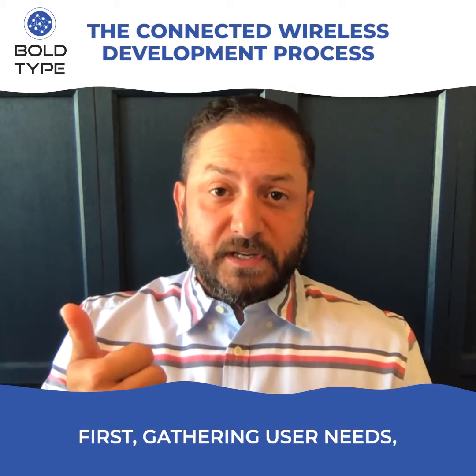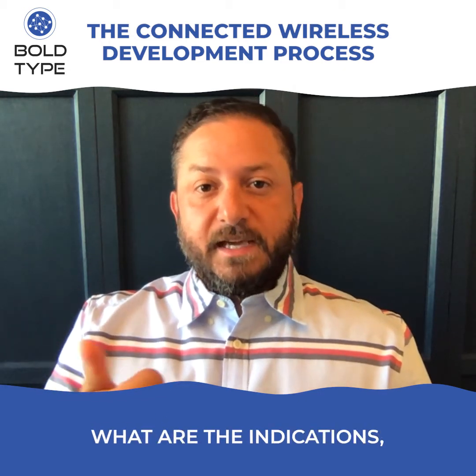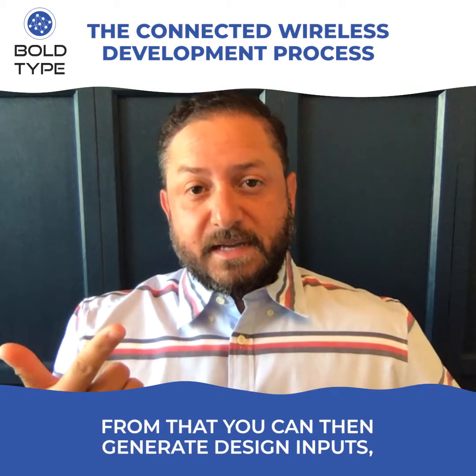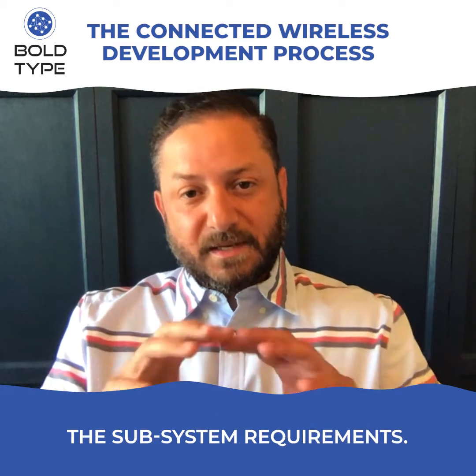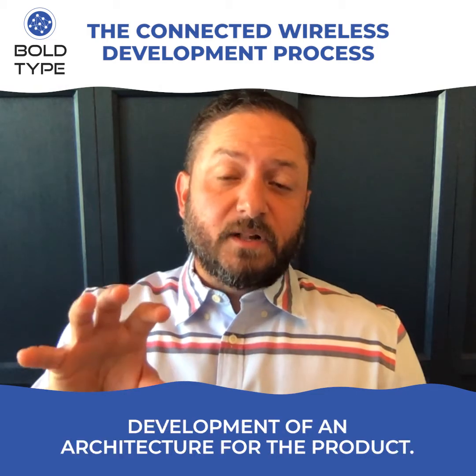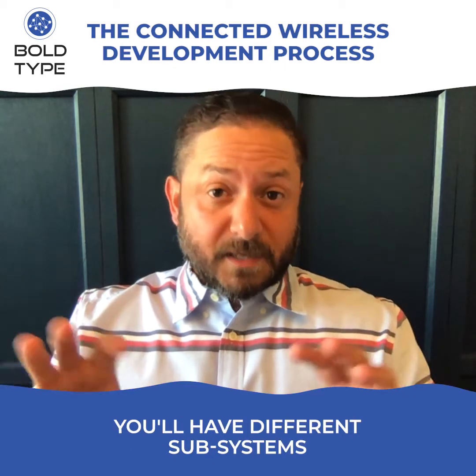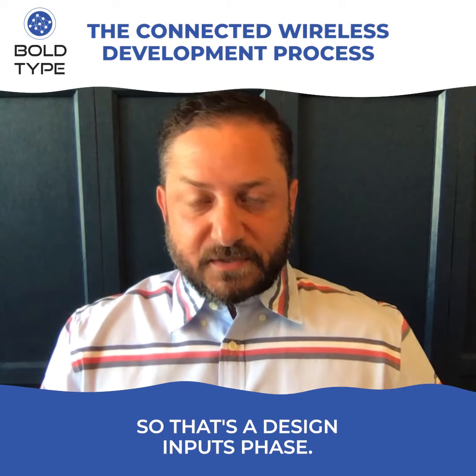First, gathering user needs, so understanding who's the user, what's the intended use, what are the indications, what are the user requirements, what does this product need to do for the user. From that, you can then generate design inputs, which are all the requirements, like the system level requirements, the subsystem requirements, and usually you do that alongside development of an architecture for the product. Those go hand in hand because depending on the architecture, you'll have different subsystems and different requirements for those subsystems. So that's the design inputs phase.